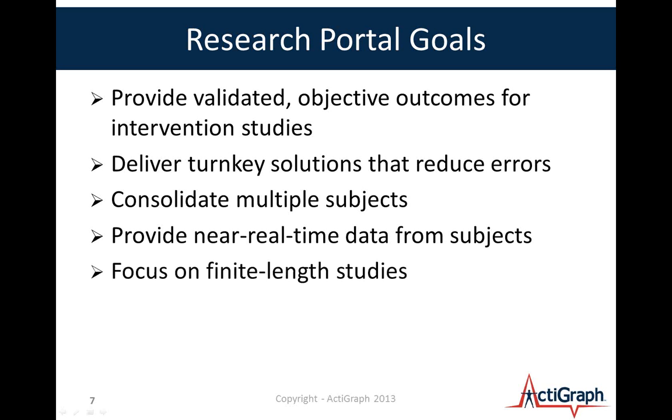And we want to focus on finite length studies. And so to date, we've offered a product that allows you to open-endedly collect data, and this system is focused on a finite duration study in which you are studying a specific outcome based on an intervention. And so we're going to talk a little bit about that.